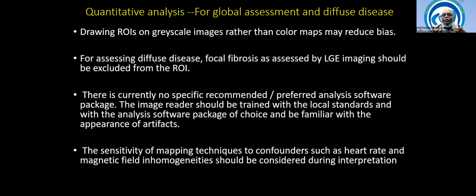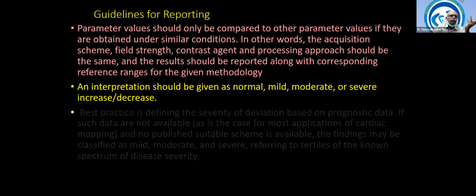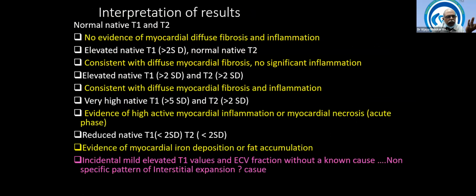Draw ROIs on grayscale images, not on color maps, to avoid the bias artifact. I'm not showing it live. Then I told you the reference standard deviation is the reference. Now, for reference also I have told you, this is an important point, a very important point for today's presentation.